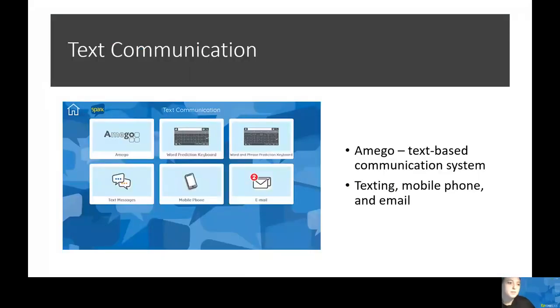When creating a profile for the first time, you can select many different MindExpress starting page sets for the portal to customize it for the user. Within Spark, we have several text-based communication page sets designed to turn text to speech quickly and naturally for users who are literate and can read and write. These page sets empower the individual to generate messages with ease as they navigate between the keyboard, word prediction, and saved phrases. You can also access text, phone conversations, email, and social media platforms.